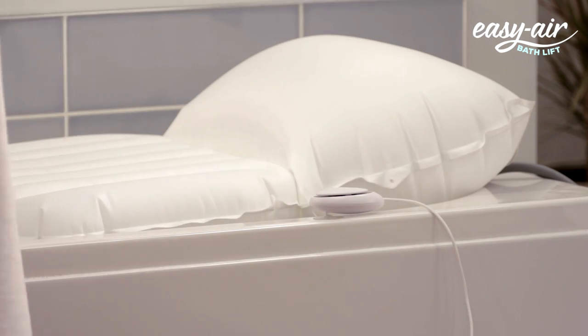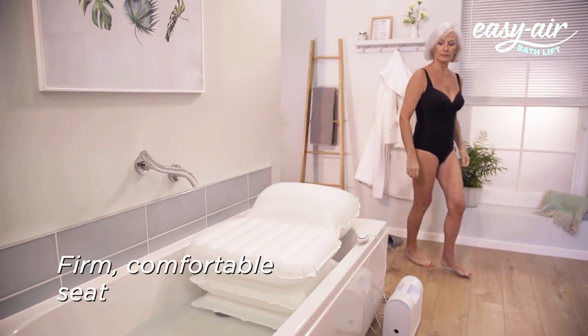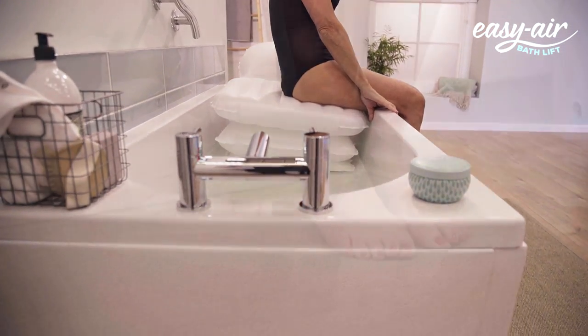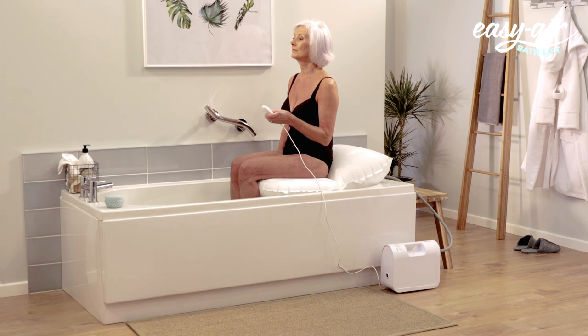Once fully inflated, fill your bath to the desired temperature. The Easy Air Bath Lift is firm, comfortable and supports up to 24 stone in weight. Simply lower yourself onto the seat with your feet still on the floor. Then, holding onto the side of the bath, slowly turn and lift your legs one at a time into the bath.